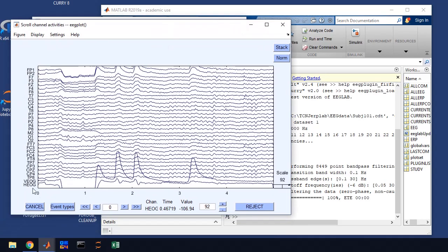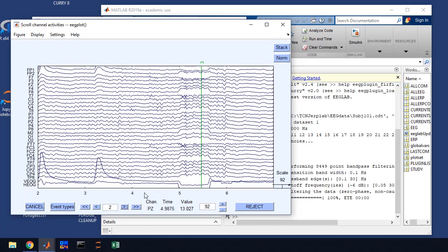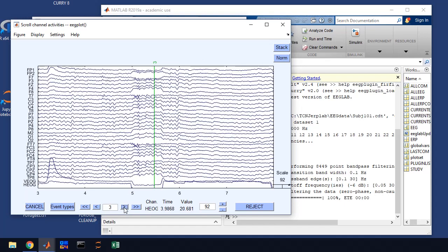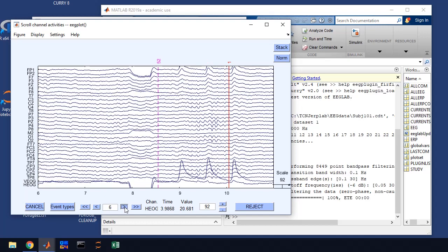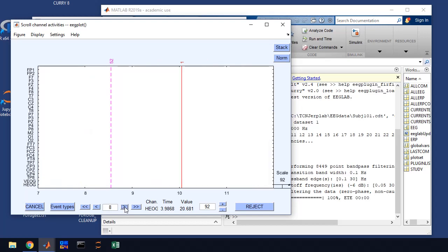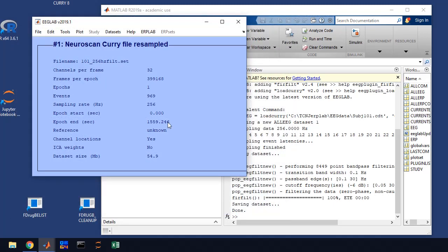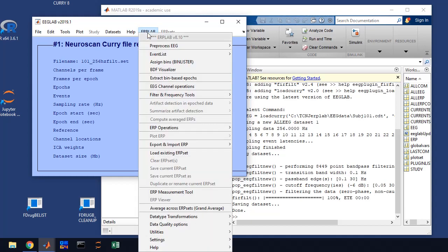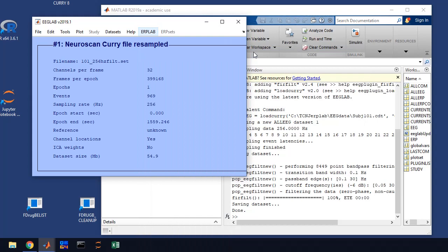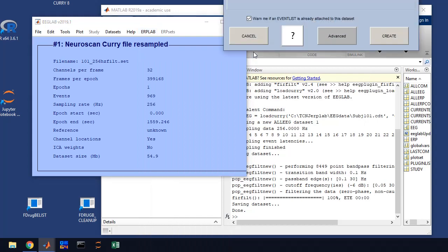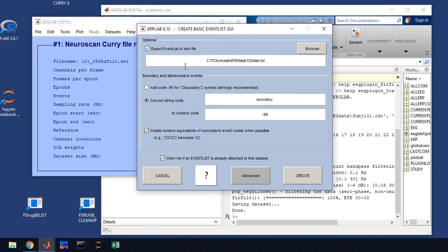Here's all the channels and of course we have time on our x-axis. And if you keep scrolling, you'll see various events. What we want to do is categorize and classify those events to ultimately create our ERPs. So we're going to be doing that in ERP Lab. What you do is go to ERP Lab, create an event list. So you're going to go to event list, create EEG event list.